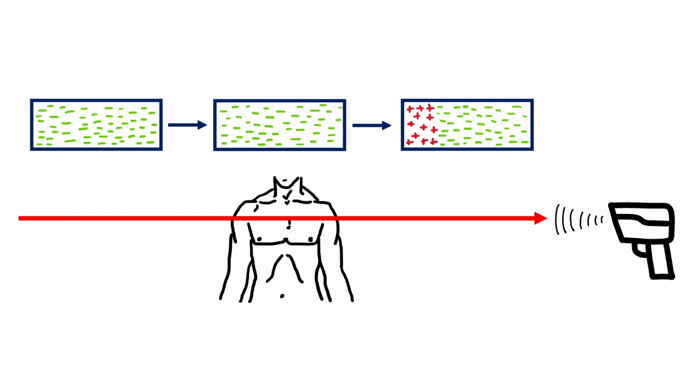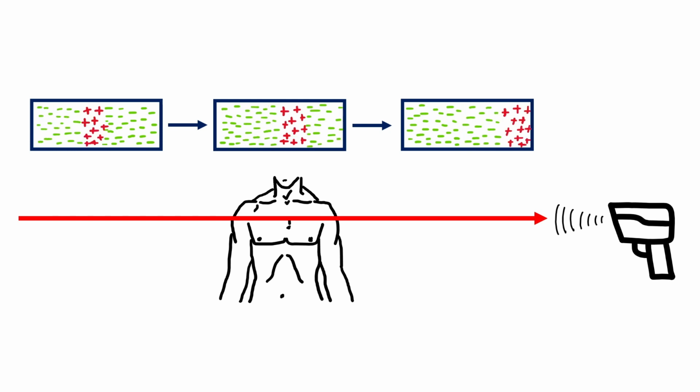Why it's useful. Now everything revolves around the wave of depolarisation, so let's discuss that first. Each one of these boxes represents a cross-section of the heart. When the cells are resting, they're generally negative. When they depolarise, they become positive, as you can see over here. Now in this example you can clearly see that the wave of depolarisation is towards the right.